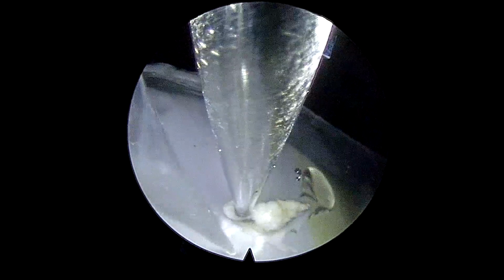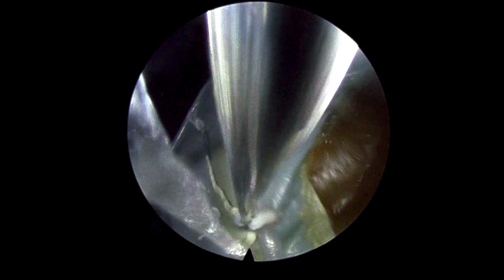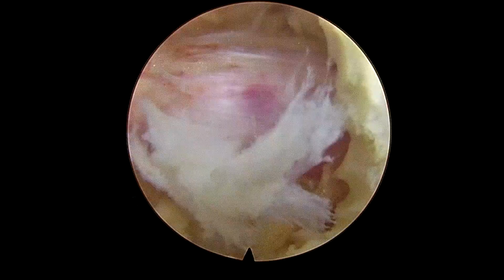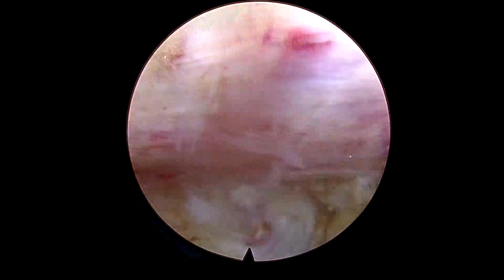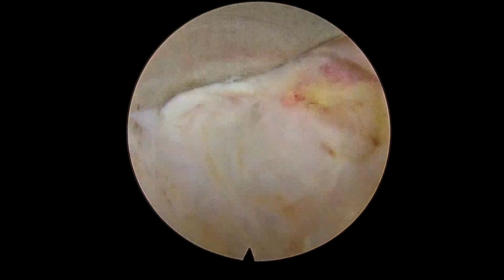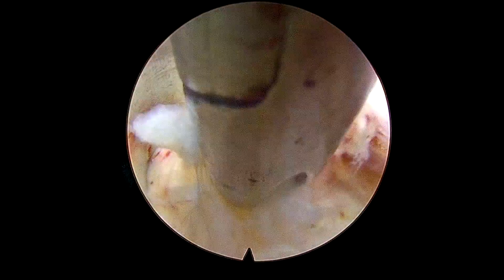So this was the larger fragment which is coming out of the disc space. So here again we have retracted the traversing nerve root medially.